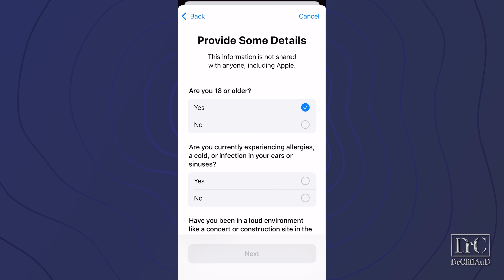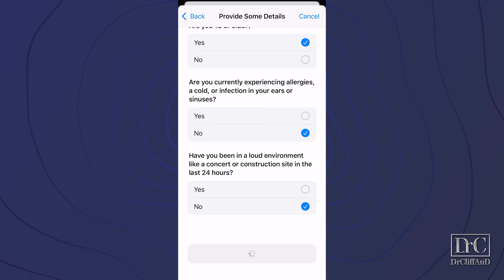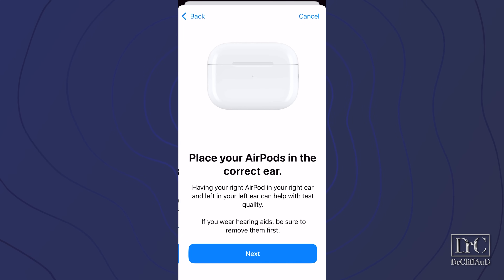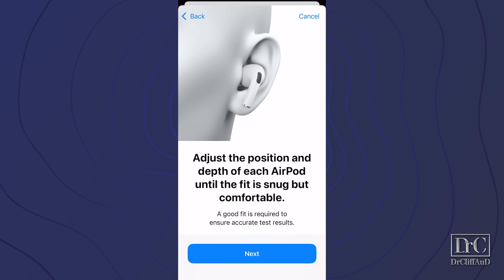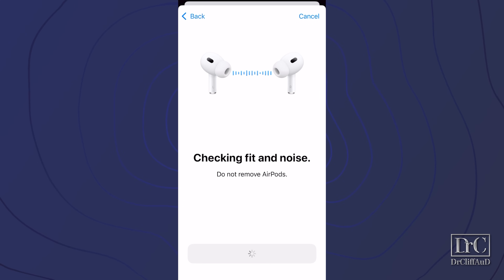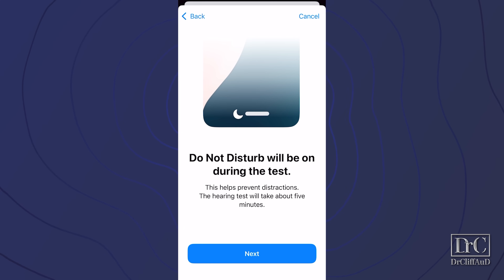After providing some details about your age, allergy or cold symptoms, and if you've been in a loud noisy environment recently, you'll be allowed to continue on with the test. The app will check to make sure that you're in a quiet environment, and then you can place your AirPods inside of your ears. It will run through a brief fit check before starting the test to ensure you're wearing the proper size rubber tip. If not, switch to a different size ear tip until you get two green check marks, then you can start the hearing test.